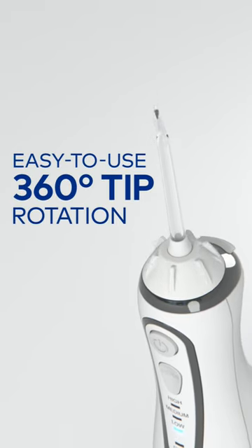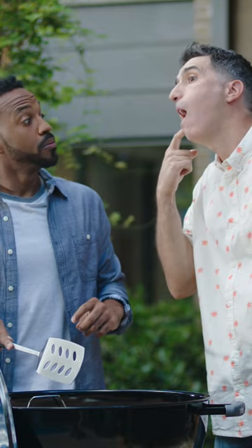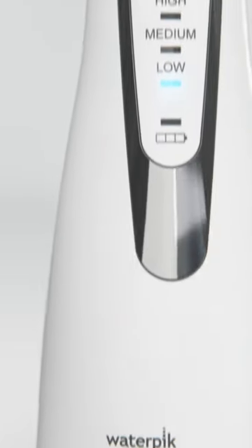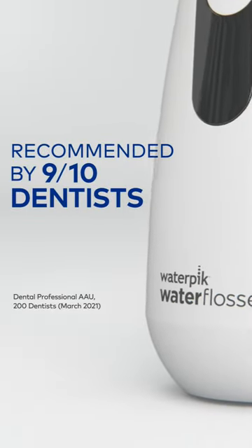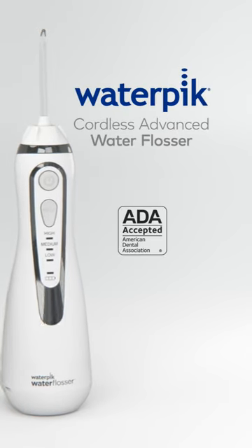The special 360-degree rotating tip easily reaches your whole mouth, even back teeth. Over 225,000 five-star ratings and the number one brand recommended by 9 in 10 dentists. Go online or ask your dental professional about Waterpik Cordless Advanced.